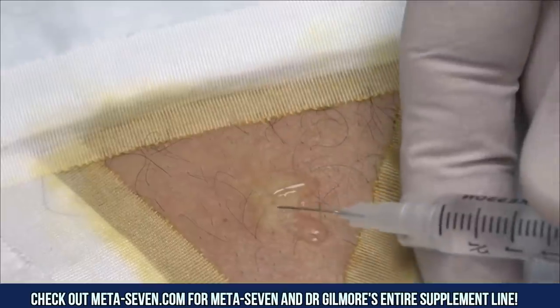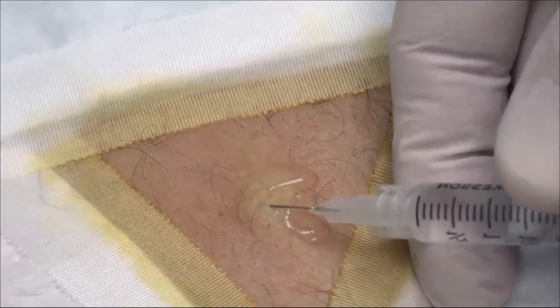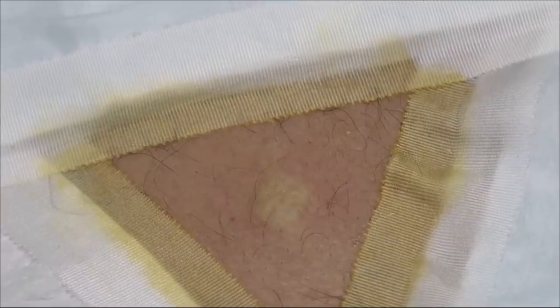I had to show Mr. Boom Boom how much weight I've lost — he didn't believe me. You have lost some weight, haven't you? Yes he has. So we're gonna inject that and we're gonna let that medicine kind of soak in a little bit, and then we're gonna take this little cyst out.